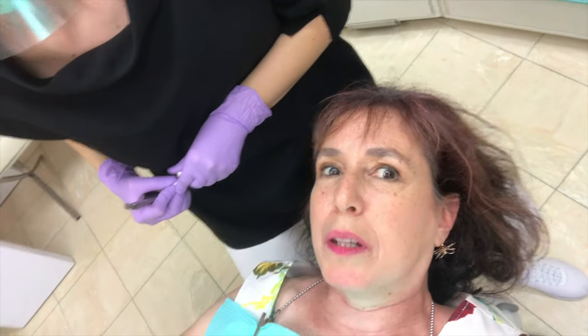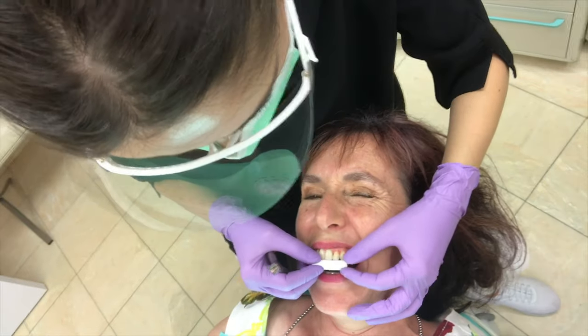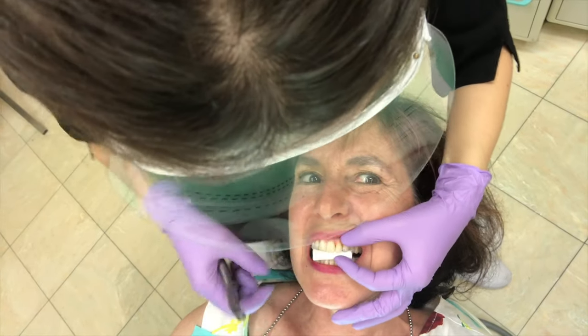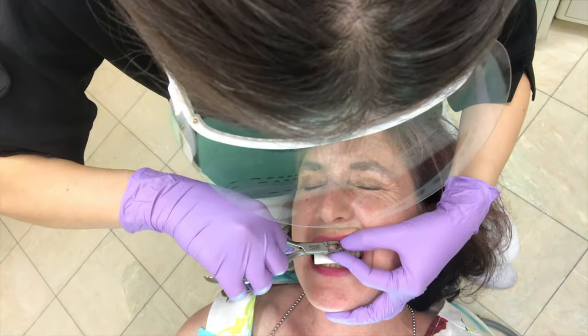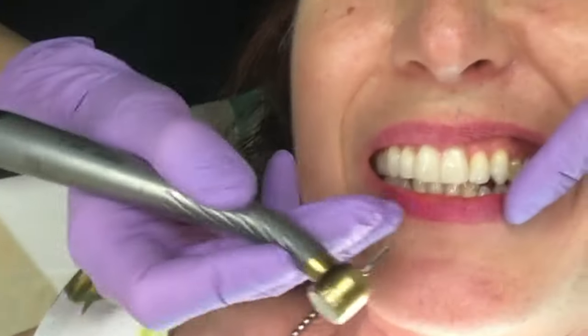I'm just going to film one removal and then the other ones will all be the same. We're going to remove this big one here on the front — that's the attachment. I have the elastic going around the tooth. Open please. Bite please, as hard as you can. Close your eyes. Thank you. All right, that's it. There we go.